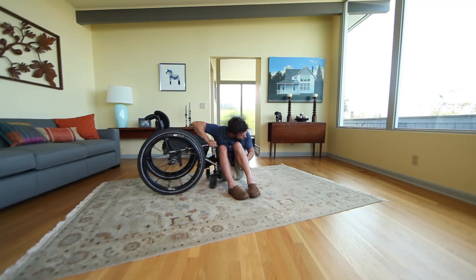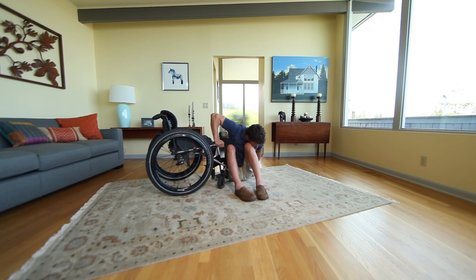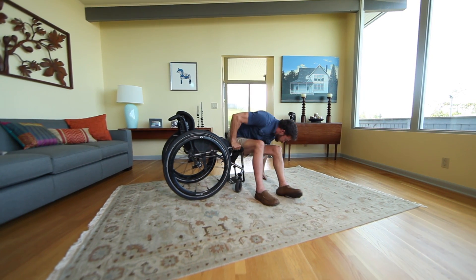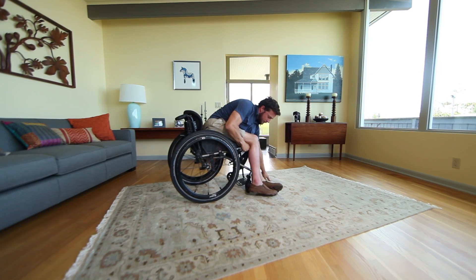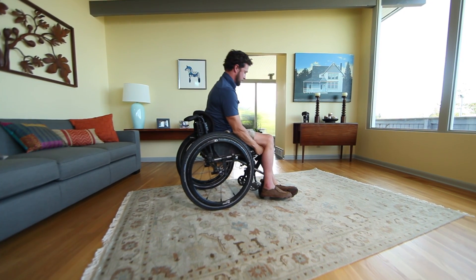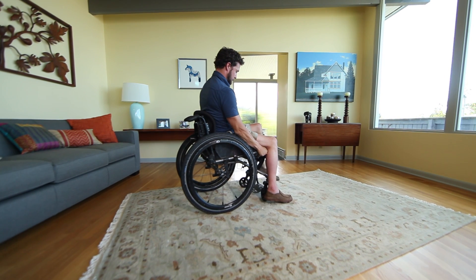Position your trailing hand in a fist down by your hip on the floor. To swing your hips up to the wheelchair, lean forward and down toward your fist. Keep your shoulders down and vault diagonally up to the front of your wheelchair. Finish by repositioning your hips and feet on your chair.